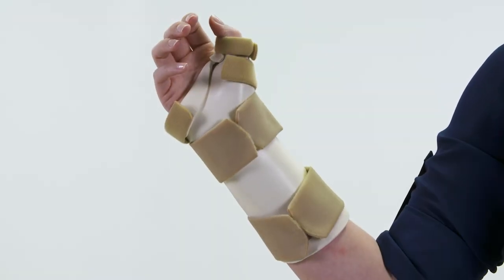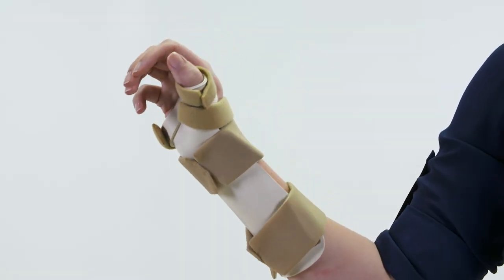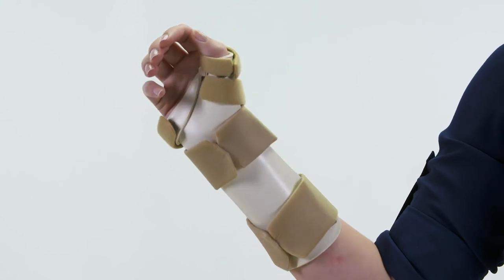Today, we're going to show you just how easy it is to create a forearm-based short thumb spica using Rolyan splint materials.